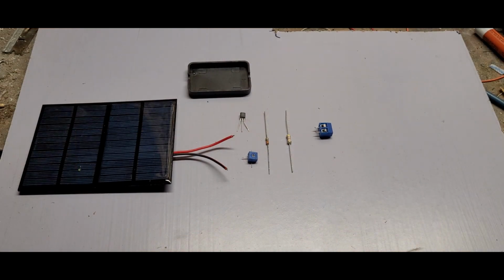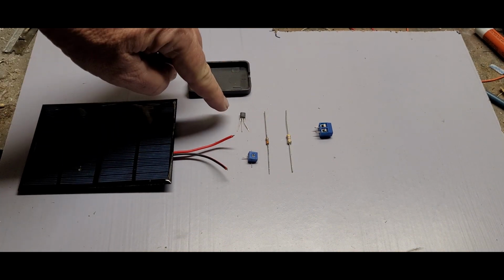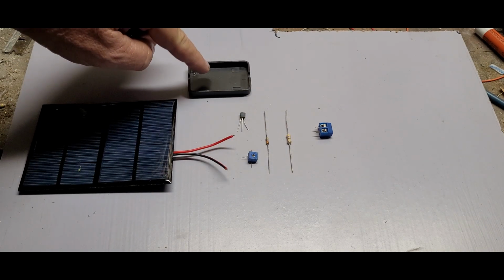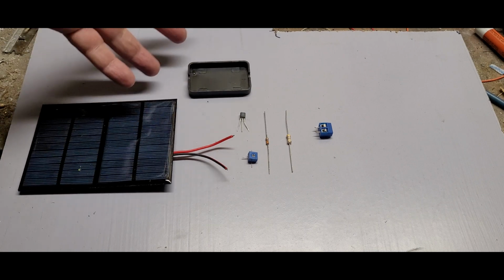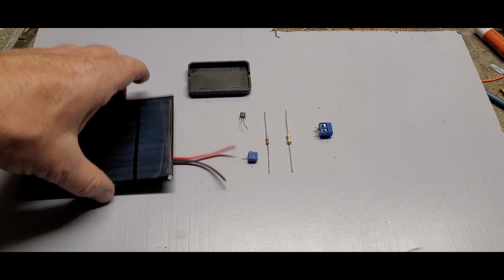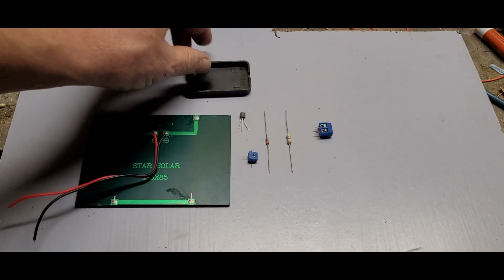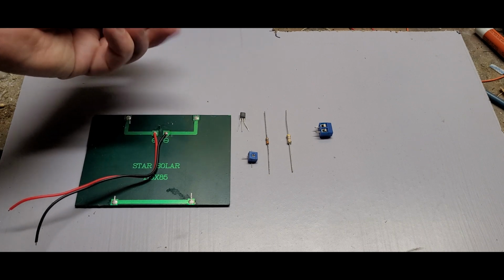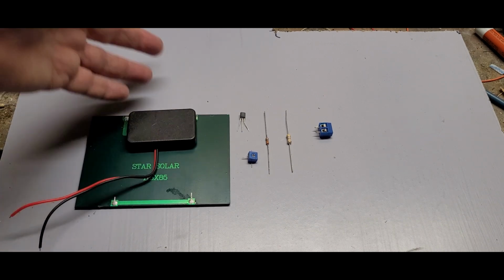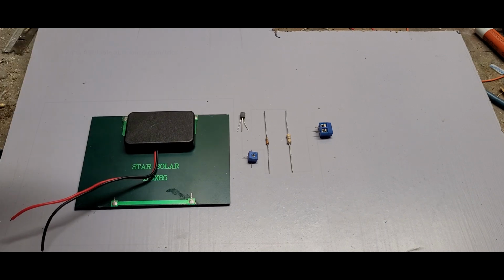All right, here we are in the shop. Here's our little solar panel. This puts out 9 volts. We've got our current regulator, our 2 resistors, potentiometer, and our wiring block there. And I got a little piece of a plastic case. Now you can use a whole plastic case of any size. I just happen to have this laying around. I thought it might be pretty slick. What I'm going to do is build the circuit inside of this little half of a plastic case, hopefully, and then we'll just glue it to the back of the solar panel, and we should have a permanent tDCS that will give us that wonderful effect anytime the sun shines.